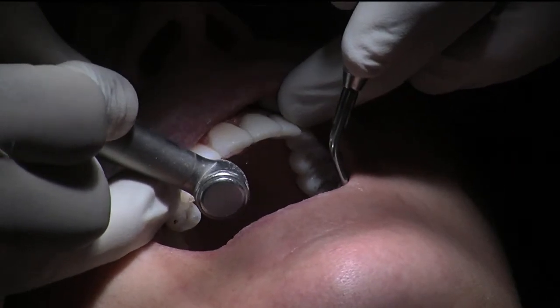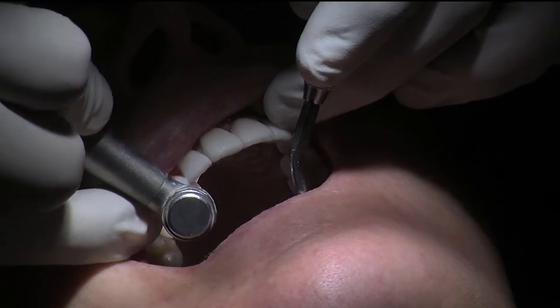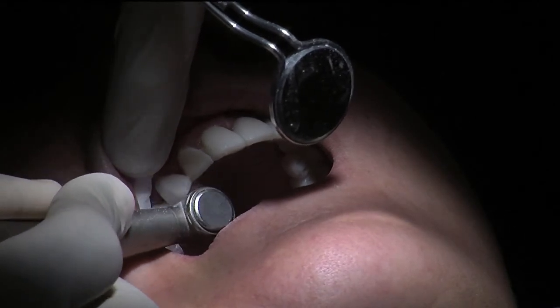I'm going to use a red rugby-shape bur — minor adjustment there, minor adjustment there. Just here on the buccal side it's a bit high. I'm going to keep following this procedure through.